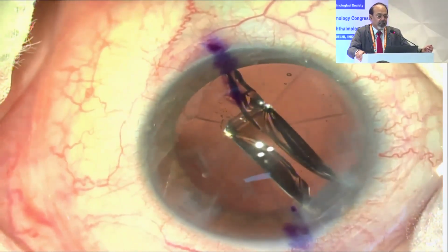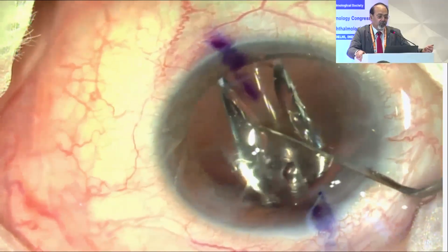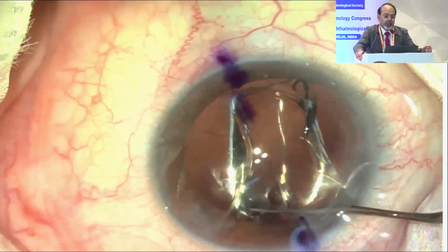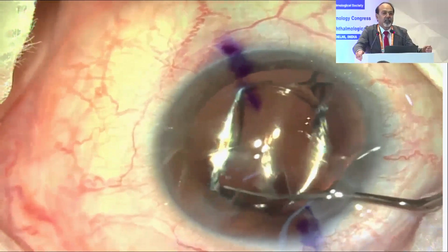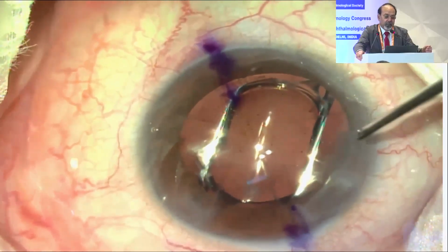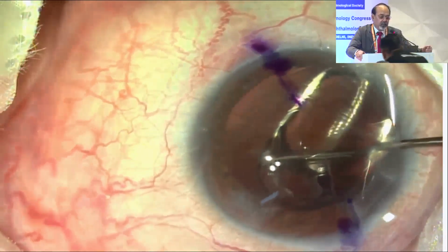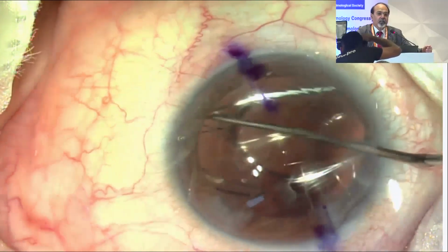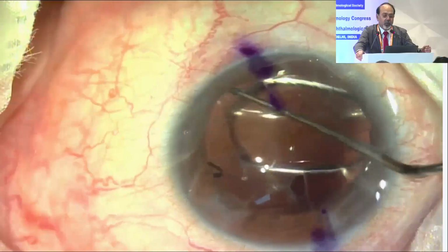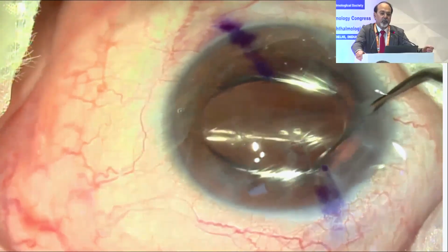And then you inject the IOL, and I would not prefer to inject it completely inside. I want to gradually insert it within the capsular bag and gently rotate it. And as you can see, despite the fact that there is so much manipulation, the lens being manipulated, there is no problem in these cuts which are there on the cornea. There is no problem of opening them.